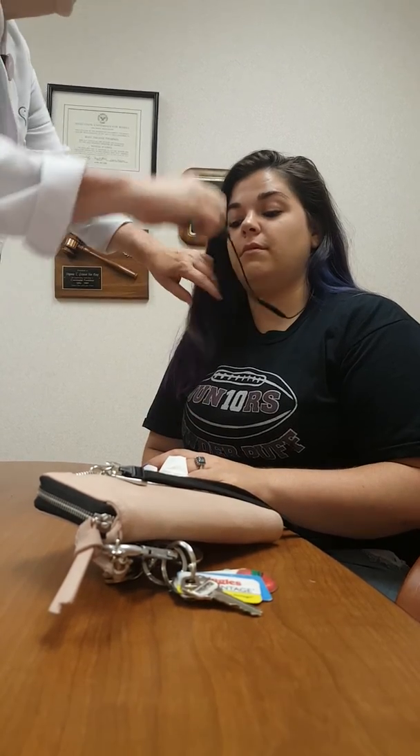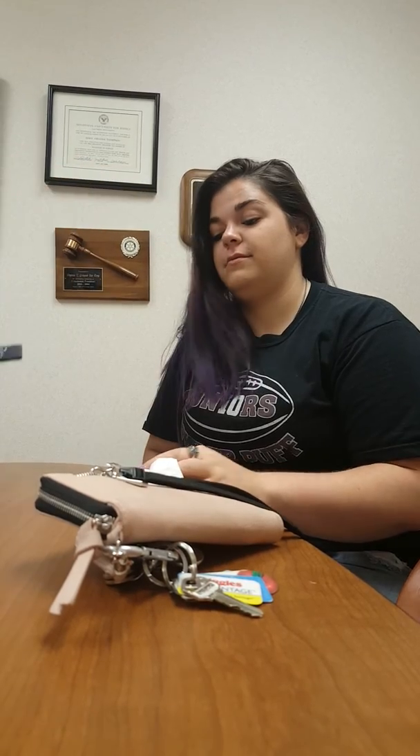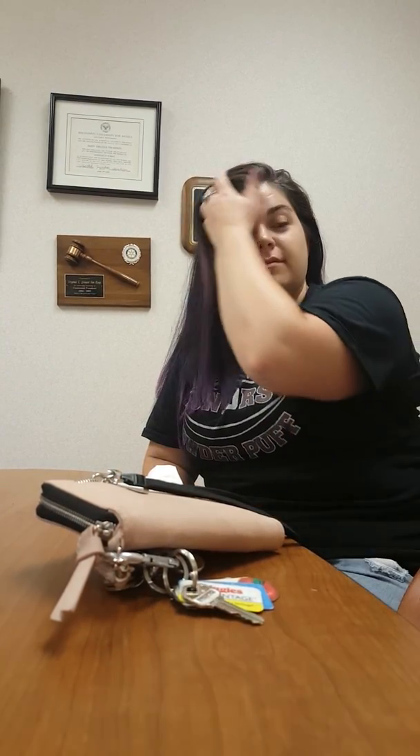It may sound like it's gonna come off right now but don't worry about it. She heard that! It's playing music now — it's coming back on. It plays a little chime when it powers back up. Oh my gosh, it's pretty pleasant though! The idea is so that when you turn the hearing aid on you'll know for sure it's on because you'll hear that. And then you'll hear a beeping sound when you need to change the batteries.